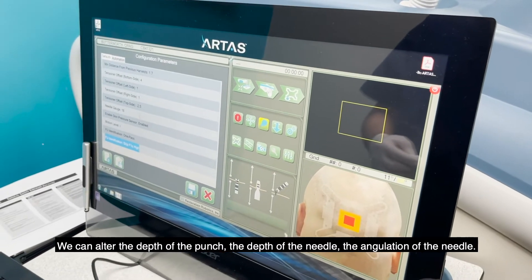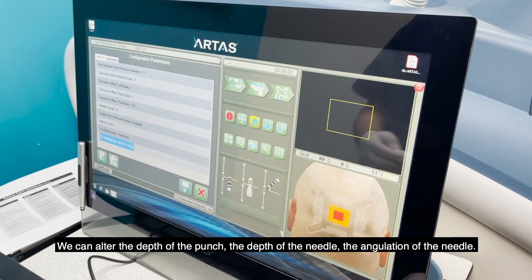We can alter the depth of the punch, the depth of the needle, the angulation of the needle.